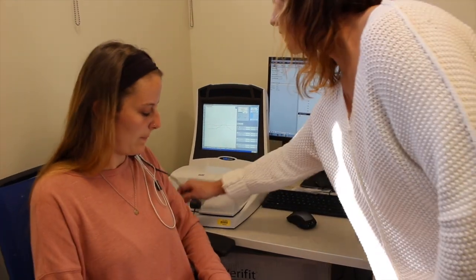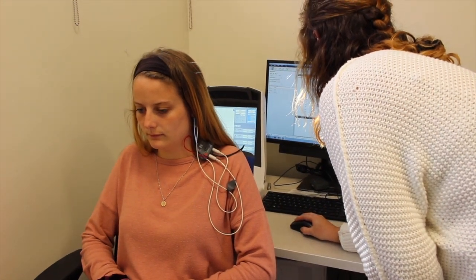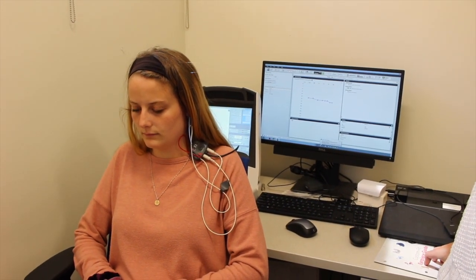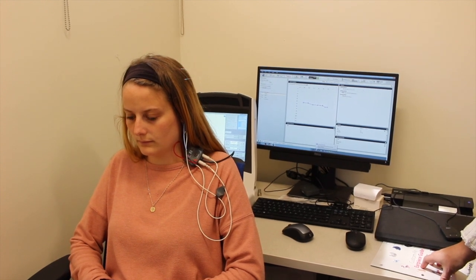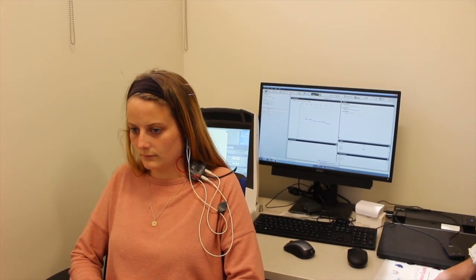This works best with a chair that can be easily rotated. Next, record another speech map with the patient in this position. Again, use pink noise and record at the same sound level as before. In this condition, it's especially important to allow the pink noise to run for at least 15 seconds in order to allow the directional microphone enough time to kick in and attenuate the sound. Once the curve has stabilized, hit record.